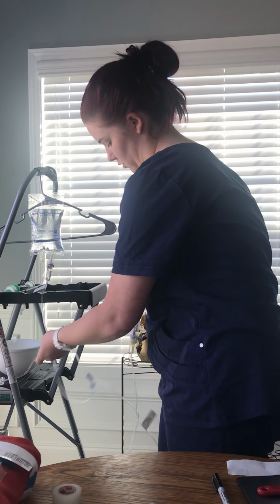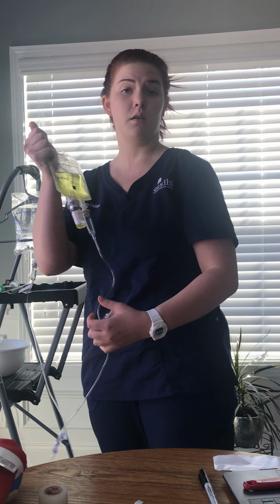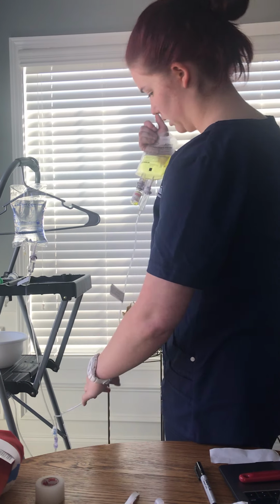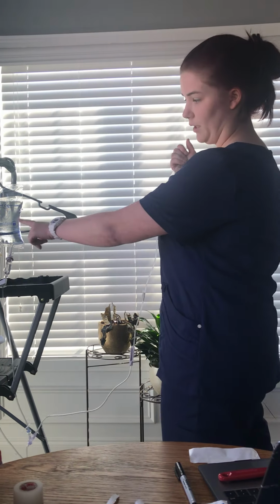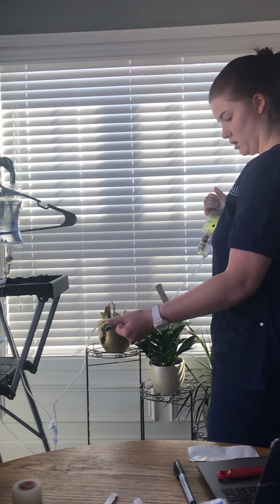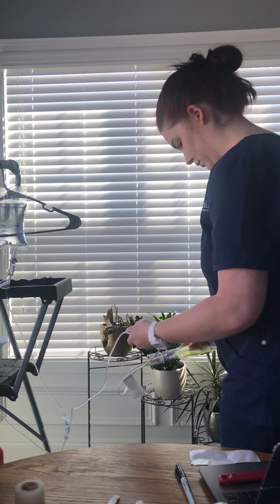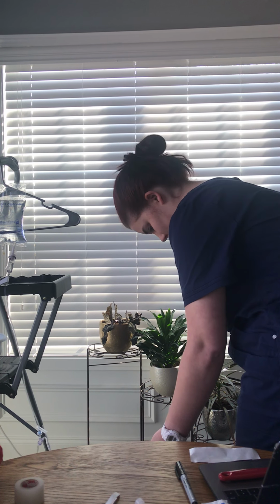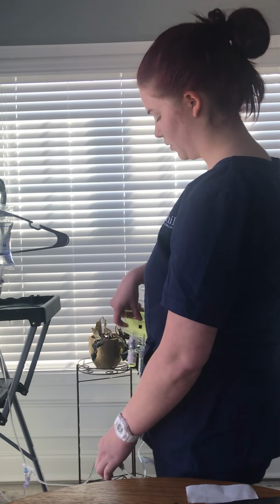Now I'm going to use the back flush method, and I'm going to let the primary fluid here get into this line to get rid of the air. So I'm going to unclamp this. And that's good. About three-quarters full there.